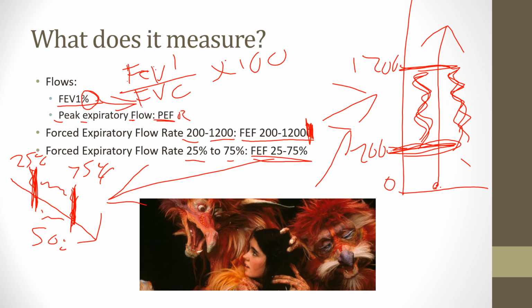Flow rate would be very, very low because those medium to small airways lose their structure. Remember, there's less cartilage the further down you go, and they're more likely to lose their structure and/or have that bronchospasm have more effect because there's less cartilage, right? There's less structure down there. So someone that has asthma or emphysema, that 25 to 75% would be really low.